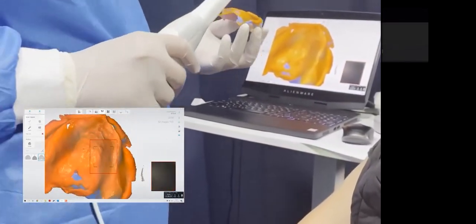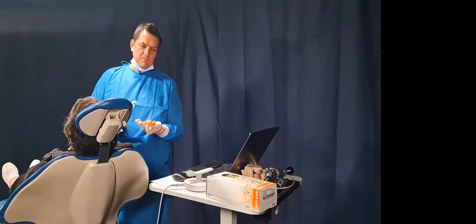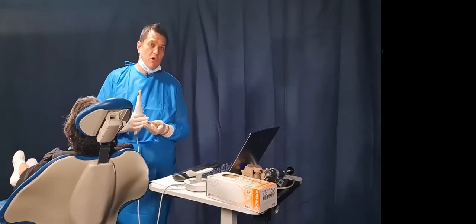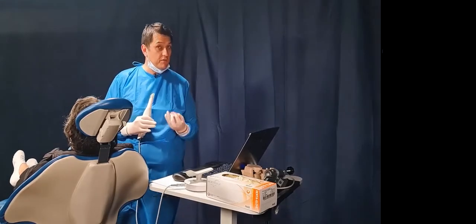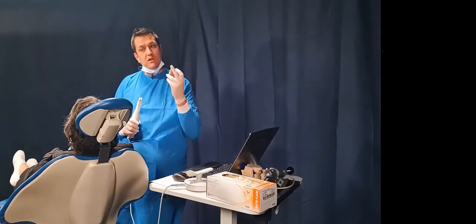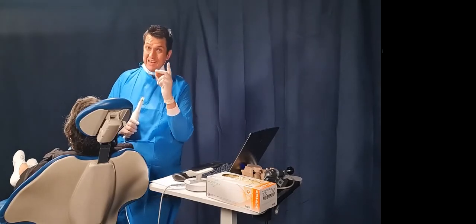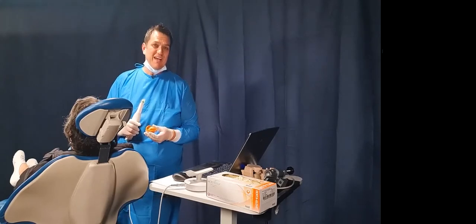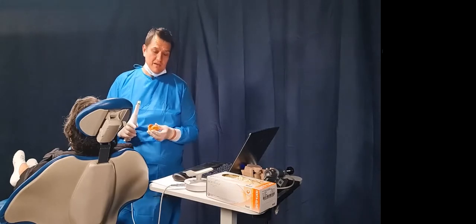This is the most common mistake. Now, firstly, I'll premise with this. We need to record the fitting surface, we need to roll over the sulcus, and we need to record the buccal of the denture teeth. And why is that? We need the buccal because we're going to put that back in the mouth. We're not going to do it today. We're going to do it next week when we talk about occlusions, or 2 weeks from now when we talk about occlusions, because it's all about occlusions, and you're going to love that.